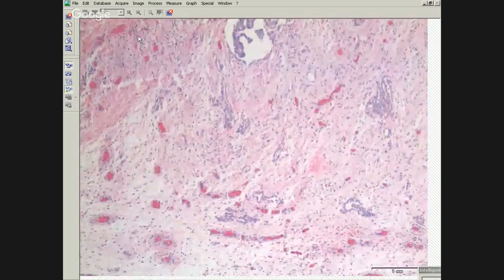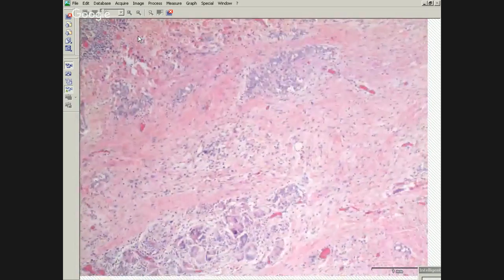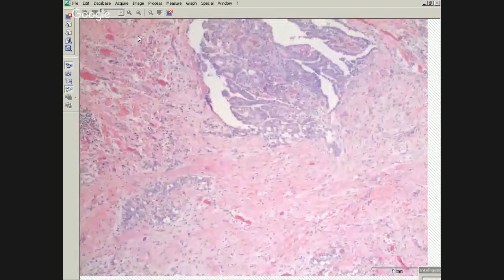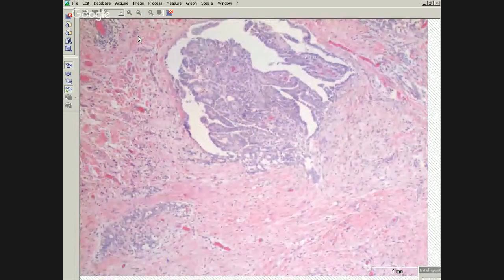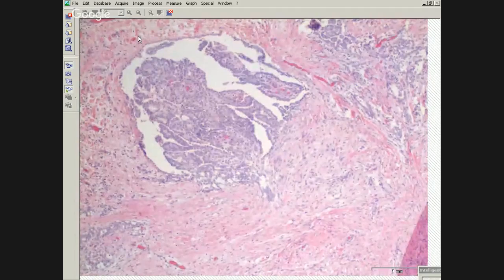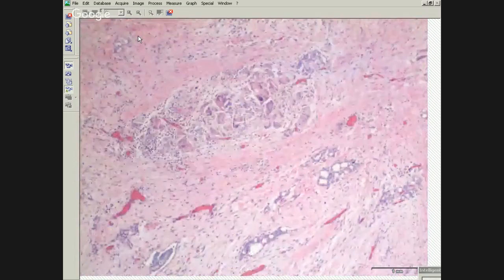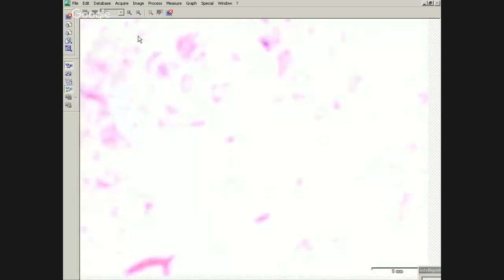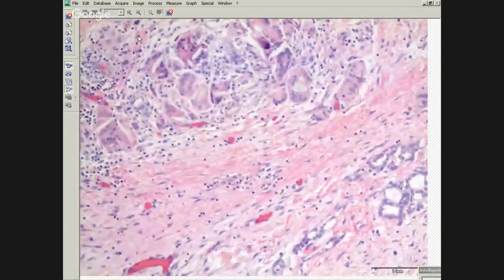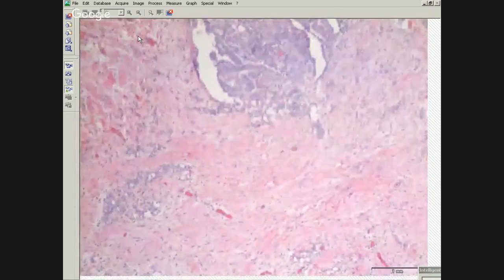Lung adenocarcinoma. Right. So essentially your differential here is mesothelioma versus adenocarcinoma, either from the lung or someplace else, with this kind of morphology. And this bit here, this guy has undergone a pleurodesis, so this is just some talc with foreign body reaction, which you sometimes see in these resected cases as well.